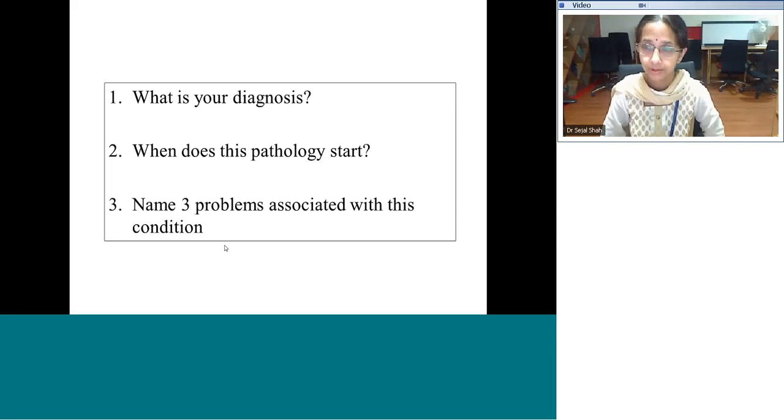Actually, if you see in this baby, the baby was very bradycardic. So whenever you're looking into the structural understanding, also make sure that you do not forget something which is so clear in terms of tachy, brady, etc. Ventricular arrhythmias, yes. LV dysfunction, yes. So that's good.